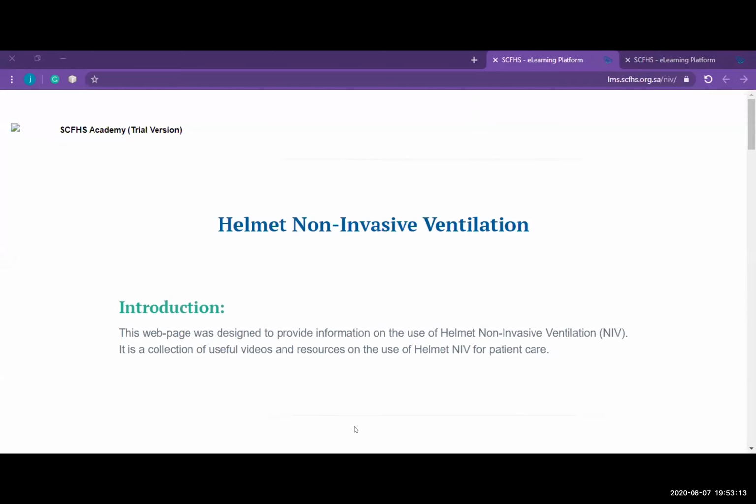The experience from the Italian experience at Chicago University is using about 50 milliseconds. This cannot be provided by most machines because they give you a percentage time or the ramp pressure, or sometimes different names, like the Draeger, which calls it the slope time. So a very fast speed will decrease the work of breathing during the helmet, so it can be easy for him to trigger and have the pressure go past.